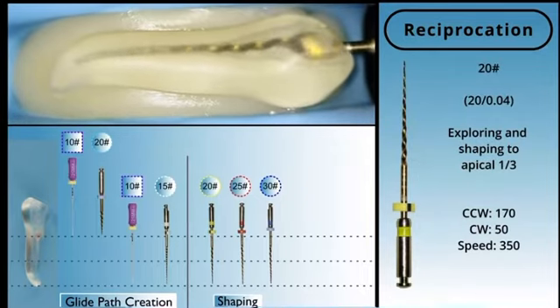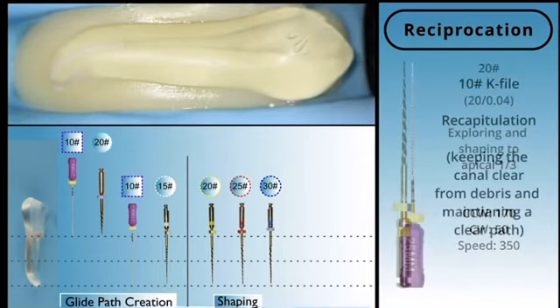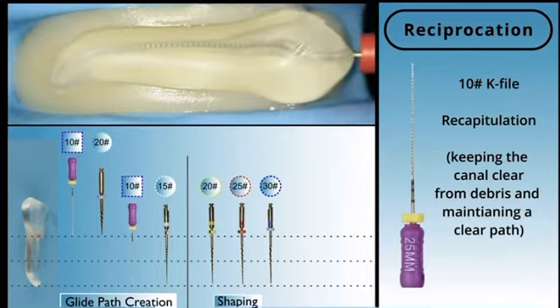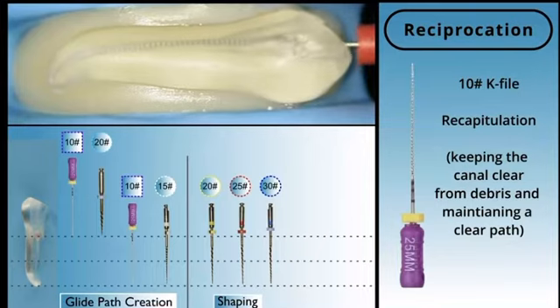And there's something that I noticed with reciprocation which was slightly different to the rotary mode, is the build-up of debris in the apical third was much more. And obviously recapitulation with the size 10 file was much more difficult, and I was also extruding a little bit of the debris past the apex, which is obviously something that's associated with post-operative pain. So that's something to bear in mind when you're using this in reciprocation mode.